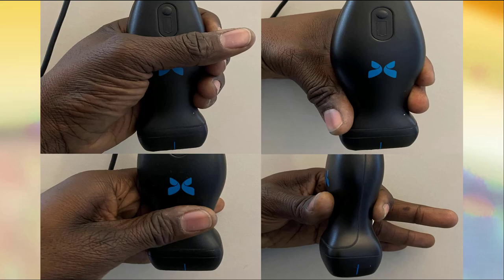There are several ways of holding the ultrasound probe. We recommend that you hold the ultrasound probe so as to view veins in a transverse orientation, at least as you're learning. Avoid applying excessive pressure with your probe, which can inadvertently collapse your vein.